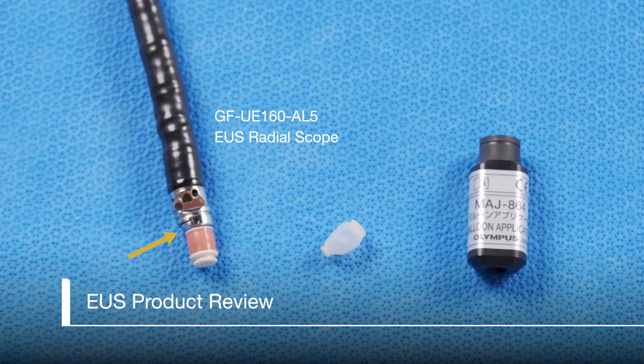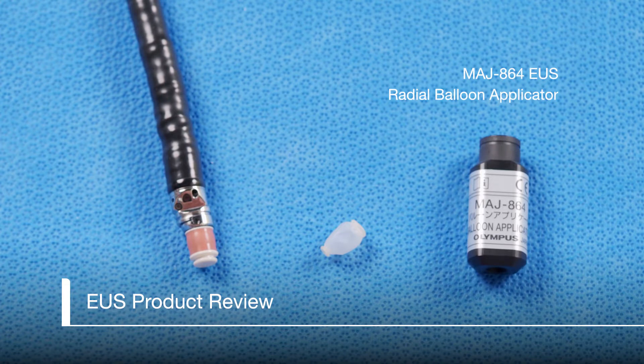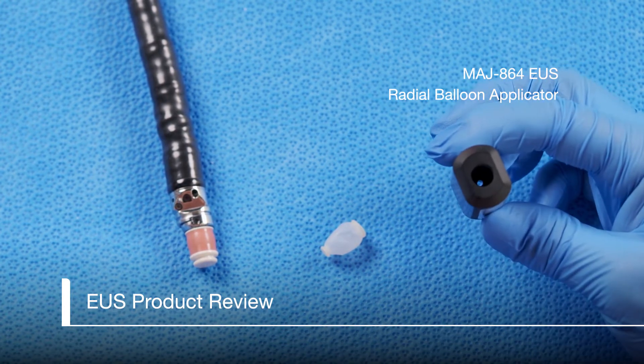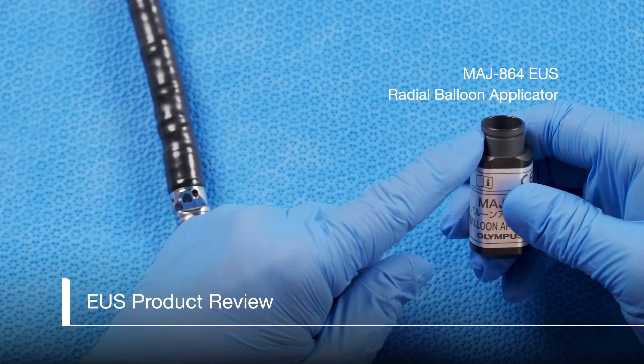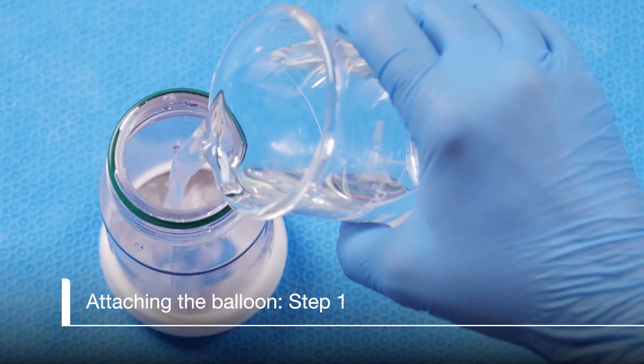Note the water and suction ports. The radial balloon MAJ233 has two rings — the distal ring is smaller than the proximal ring. The radial balloon applicator MAJ864 has two holes, the same as the balloon. The side with the larger hole will be used, and there is a groove for the ring on the balloon. Now that we have all the parts assembled, let's begin the process of getting the balloon on the scope.